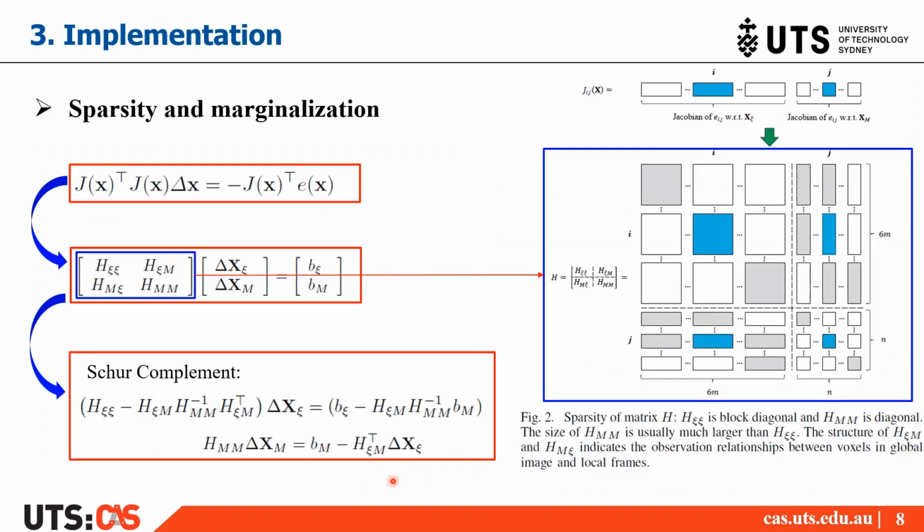Solving the GN equation directly usually needs a lot of computation resources and time due to the large size of the coefficient matrix. A 3D image usually contains millions of voxels in one single volume. Reconstructing a global image with several 3D images, the size of the coefficient matrix of the GN equation will be in the tens of millions multiplied by tens of millions.